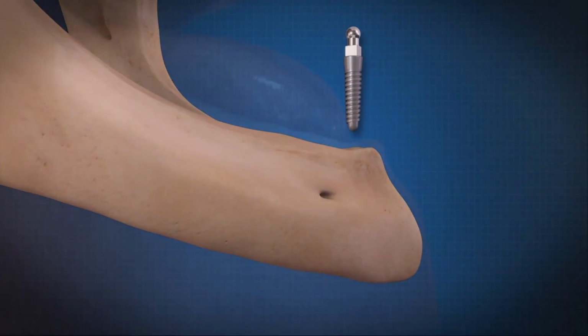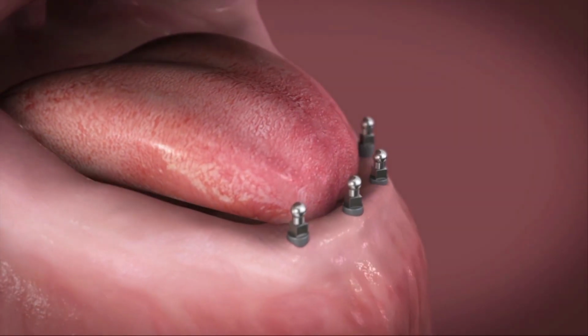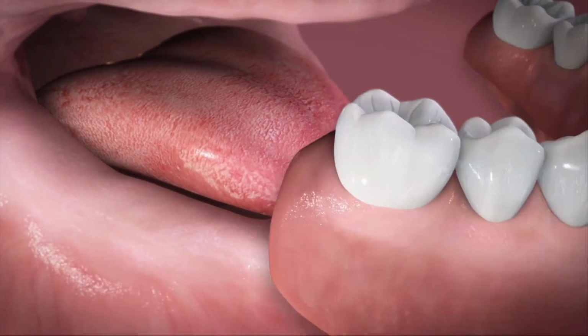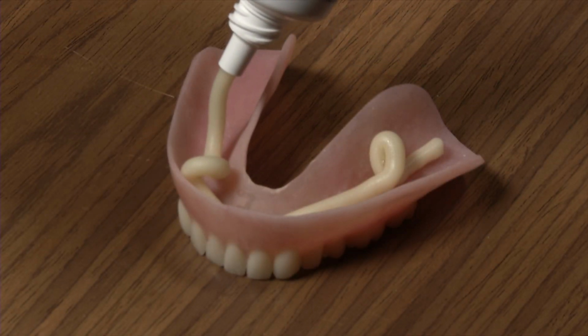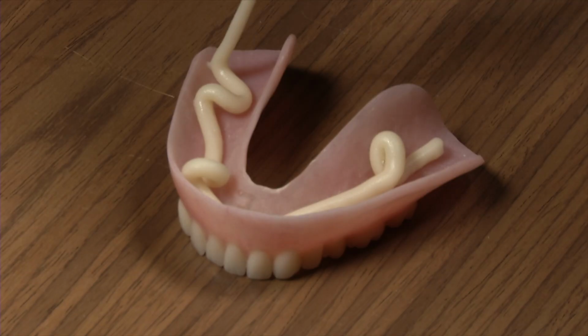First of all, I think most people get introduced to mini dental implants via lower denture stabilization. And that's my favorite treatment to do on patients. People come in suffering for years and years of a loose lower denture. They have it remade 100 times, relined, and it just never fits right in their mouth. They'll be talking, they'll be laughing, it'll pop out. It's the quickest appointment that we can do to really change someone's life. Could take them from about 10% function to 60%. That 50% jump is massive in terms of being able to eat, laugh, talk without the fear of people around you knowing that these are false teeth.